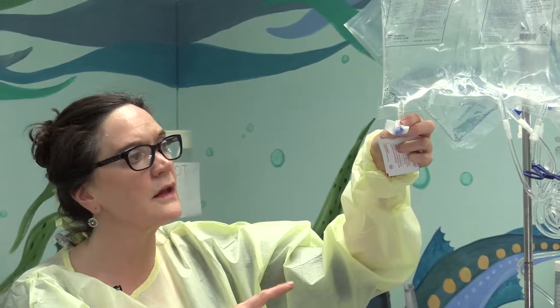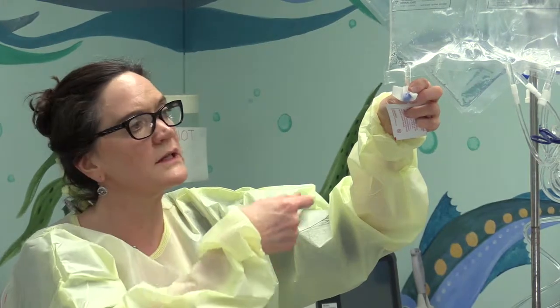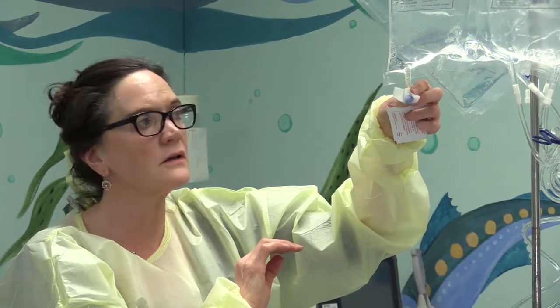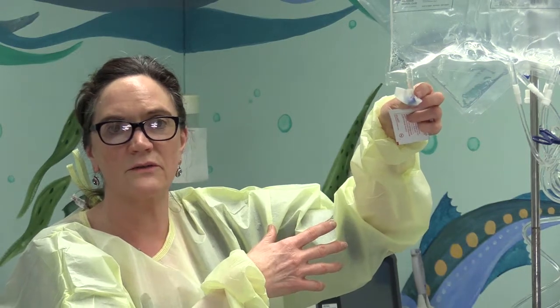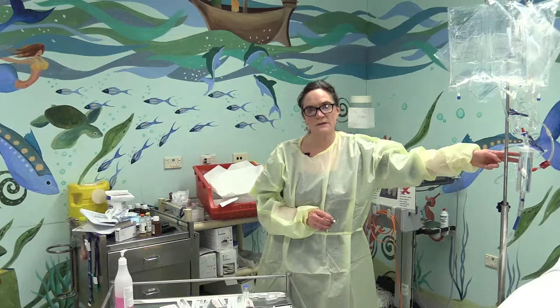Anything you add to the peritoneal dialysis fluid potentially is an infection risk. So every time you inject or put a needle into the port, you risk contamination. So you have to be very, very careful about aseptic technique when putting additives into the fluid. Now I'm going to show you how to add the antibiotics to the burette.